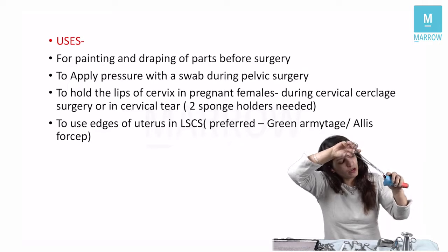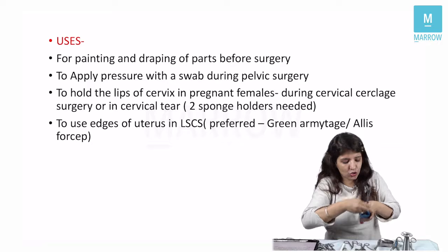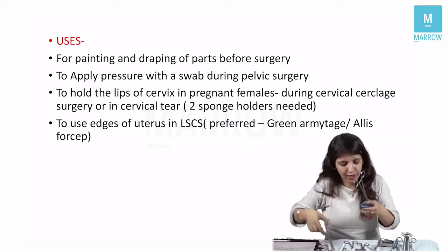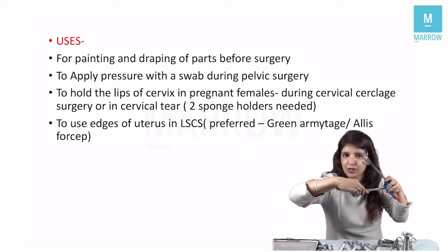One sponge holding forceps at 12 o'clock position. I don't have another sponge holding forceps. Another sponge holding forceps at 3 o'clock position. So you will examine the cervix like this.